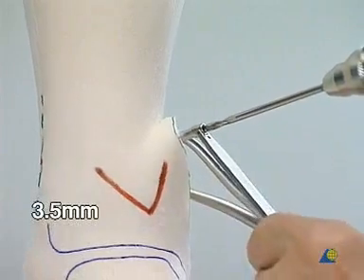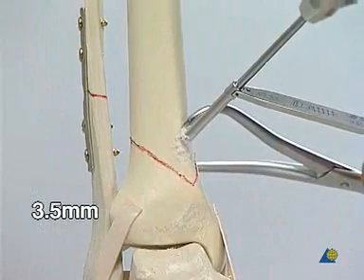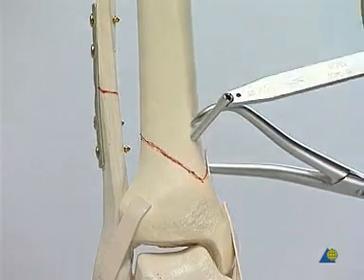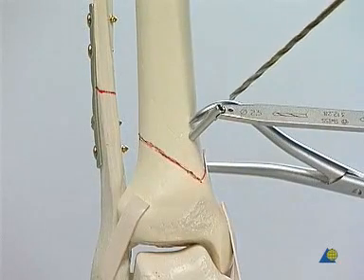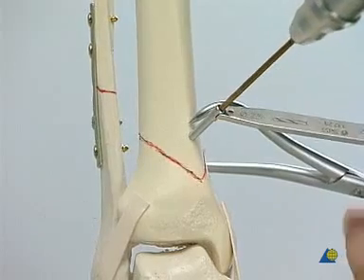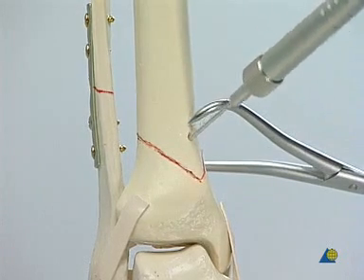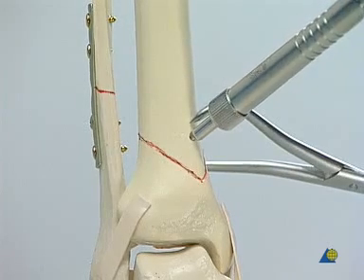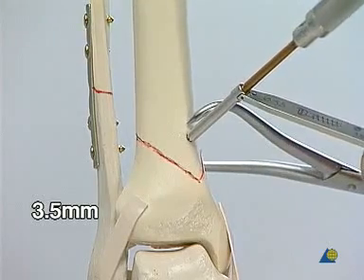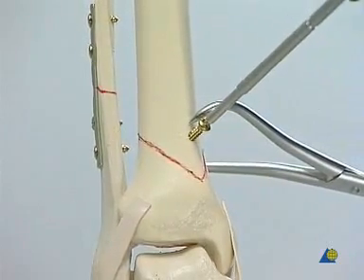The independent 3.5 millimeter lag screw is placed at a right angle to the fracture plane, starting with the 3.5 millimeter drill bit for the glide hole. The best direction is usually parallel to the plane of the reduction forceps. The 2.5 millimeter drill sleeve is inserted into the glide hole to direct the 2.5 millimeter drill bit for the thread hole. The length is measured with the depth gauge. The 3.5 millimeter cortex tap and the appropriate sleeve are used to tap. The 3.5 millimeter cortex screw is inserted without countersinking. The forceps is removed.